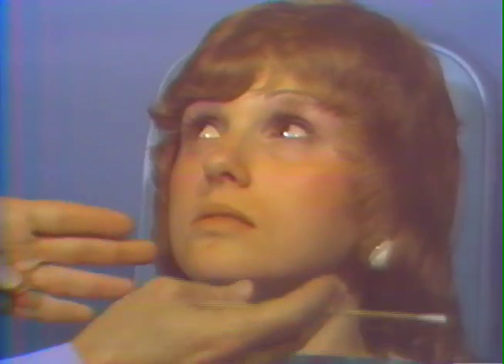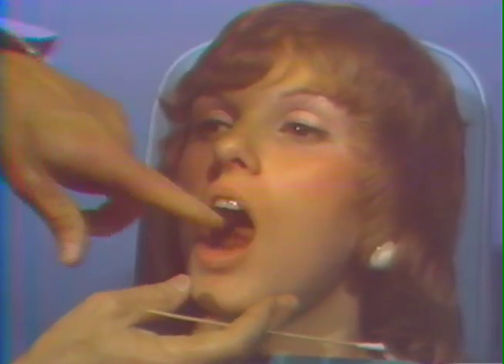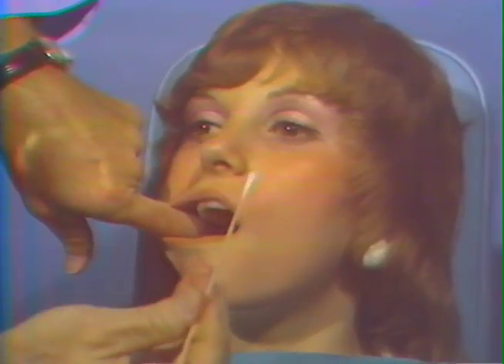The alternate technique for the inferior alveolar and lingual nerve is to utilize a cotton applicator. It may be done in this manner. Turn just a little bit towards me, open wide, retract the cheek sufficiently, take the cotton tip applicator and hold in the area, now open a little bit wider, in the area of the coronoid notch, retracting with your finger or retracting with the cotton tip applicator. For the left inferior alveolar nerve and lingual nerve, now open your mouth. Don't let me turn your head. Hold it like that. Now open.